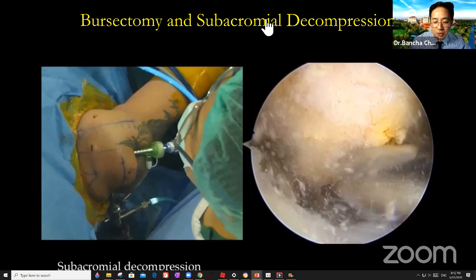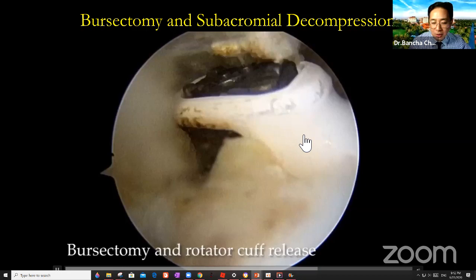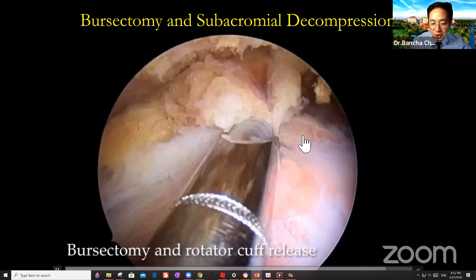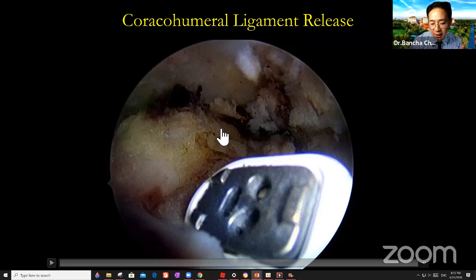First we do the subacromial decompression. He also has an acromial spur. After we remove the spur, I clean the subacromial bursal tissue, and then we remove all the bursal tissue to expose the tuberosity. I feel that this piece of bone cannot be easily reduced because it's chronic. I think it's 2 years from this injury.